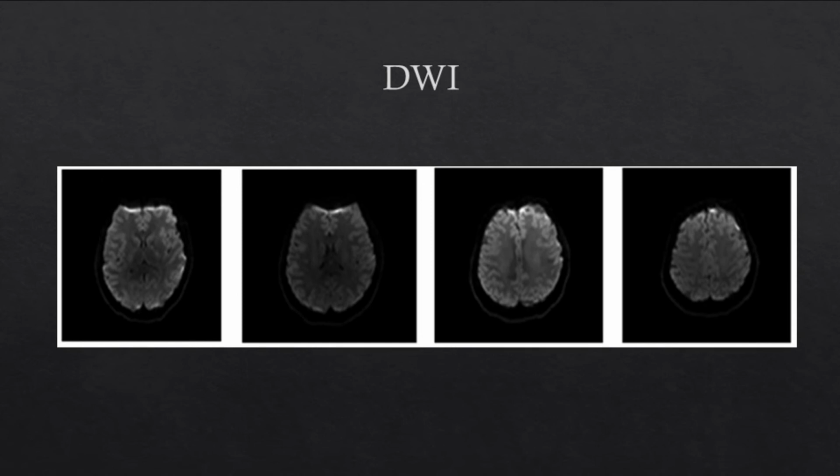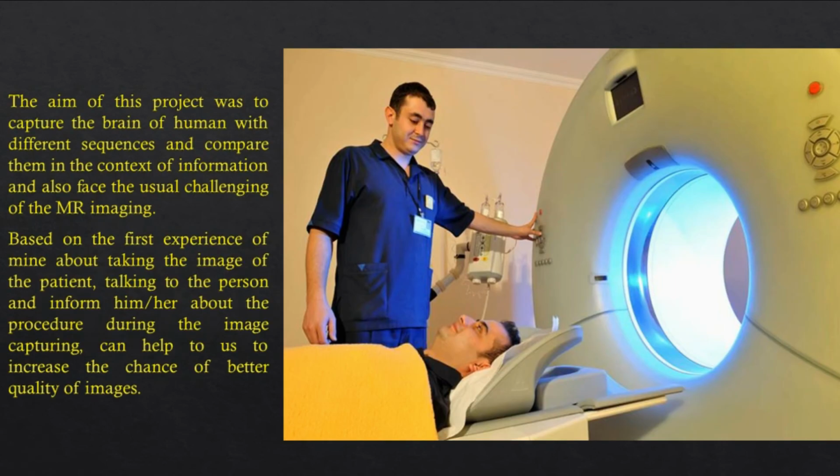Thank you. Would you please tell me about the instrument that you put on for imaging? Were you uncomfortable? Did you feel panicked when you were inside of the machine? First of all, when I saw the instrument, I felt panic because I thought I was going to feel a lot of pressure in my throat, but after putting it on, I felt better, and when I was inside the machine, I felt some stress, but when the procedure started, talking of the operator during the imaging helped me to cope with this feeling. Thank you very much.